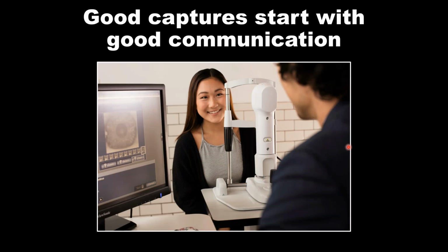Now, a good capture really starts with putting the patient at ease. In fitting an adult patient, obviously, they're a little more comfortable with instruments coming toward them, but they're used to the puff test, used to instruments that may be invading their space. So explain to them that this is really just a camera. We're going to bring the camera close to your face, but it's not going to come anywhere near your eye.